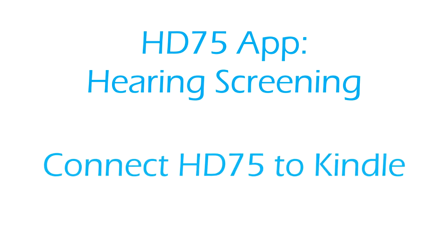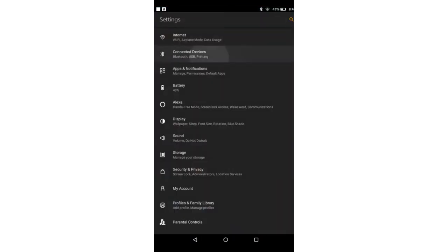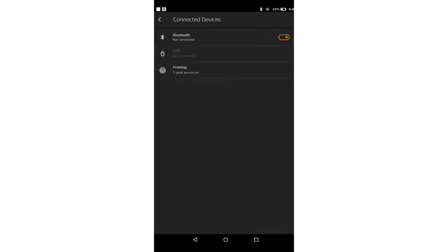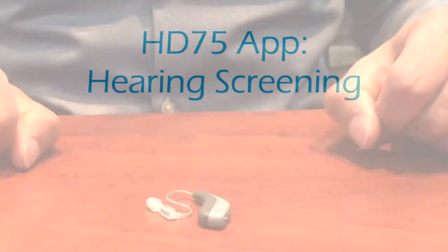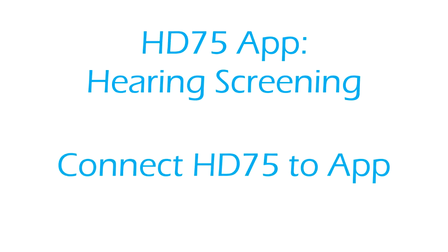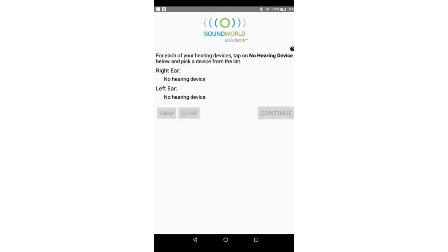Hearing screening — connect HD75 to Kindle. Go into the Kindle settings and select Bluetooth. Make sure Bluetooth is turned on. Insert a battery into the HD75 and close the door to turn it on. To connect HD75 to the app, open the HD75 app. On the initial screen, tap on No Hearing Device under right or left ear, whichever ear you want to run the hearing screen on. Select the HD75 listed according to the serial number. You should see a green dot next to the selected HD75, which verifies it is connected. Tap Continue to move to the next screen.